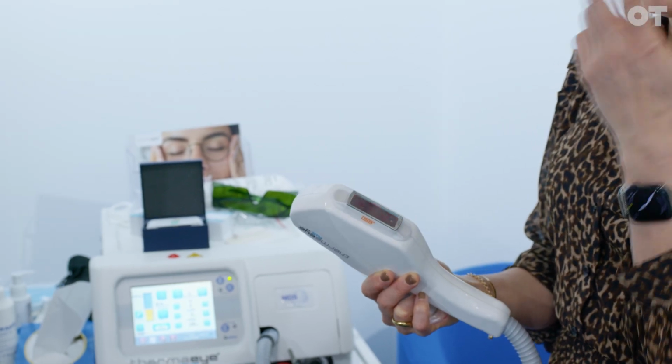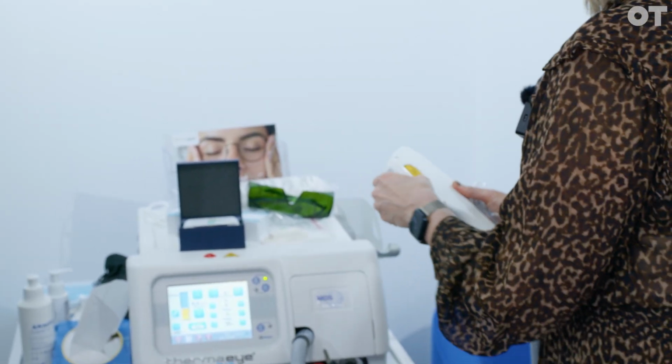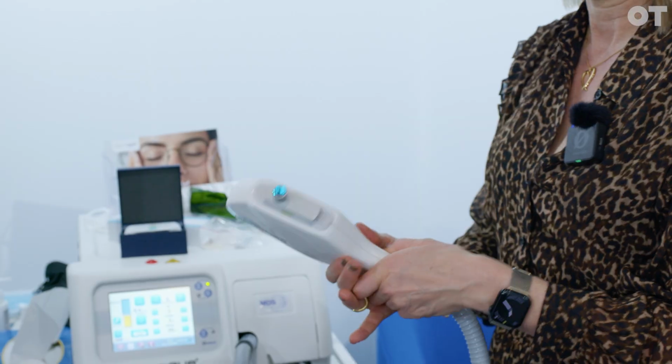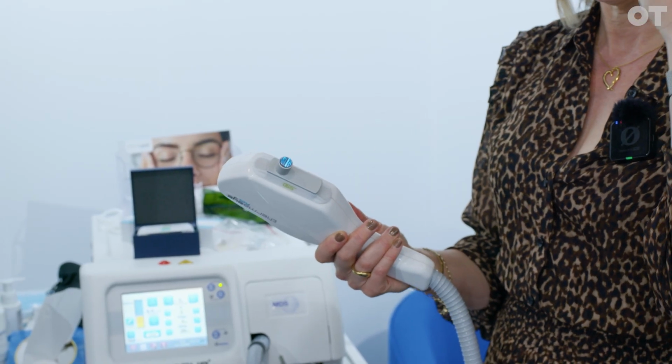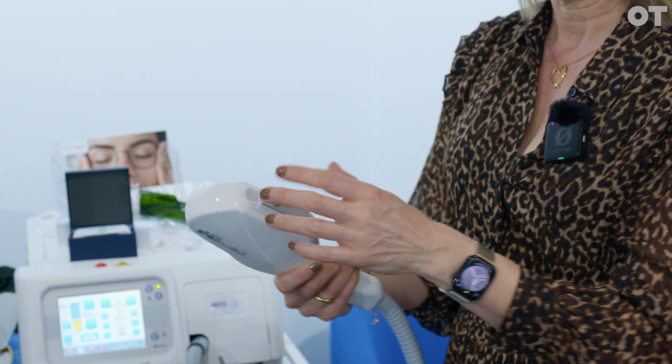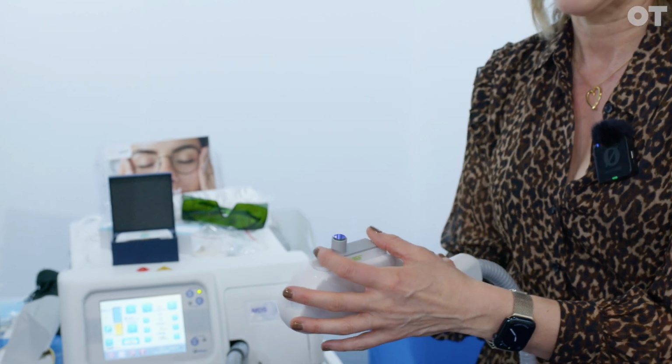The new thing that's come out, which a lot of the IPLs don't have, is the new filters that they've brought out, which target smaller areas. If you have a chalazion on the upper lid, you would put anaesthetic and a corneal shield in, and then you can treat the chalazion directly. You would struggle to treat an upper lid chalazion with a larger area. So these are very specific. The other ones are also there. You can do thread veins on noses and small skin issues. I don't particularly get involved with that, but you could if you wanted to go down that road.